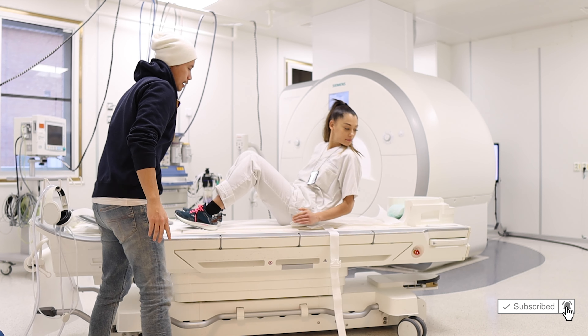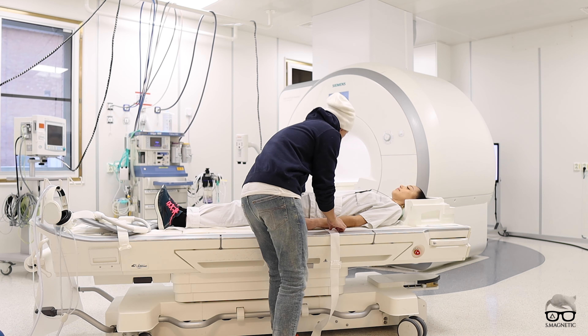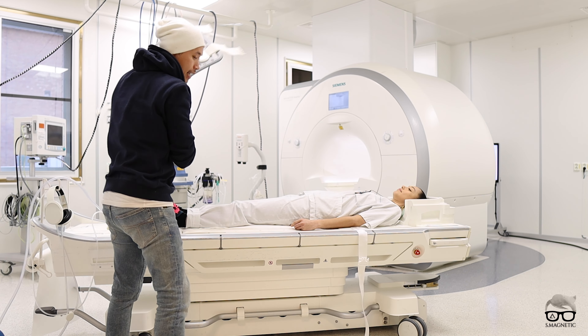So Lina, please lie down there. As you can see, I have something special behind here, and I'm just going to show you guys pretty soon.